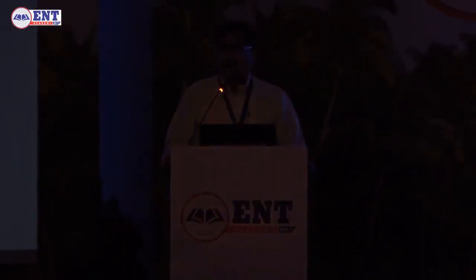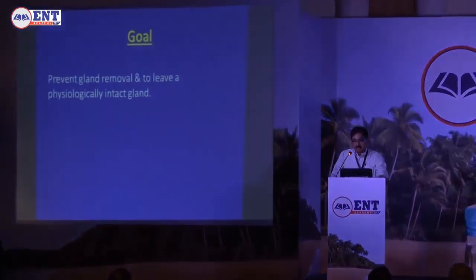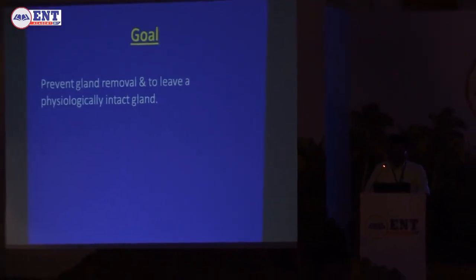Okay. Now, the topic is salivary gland endoscopy, or sialendoscopy. The goal of the procedure is to leave a physiologically intact gland and to avoid open surgeries.